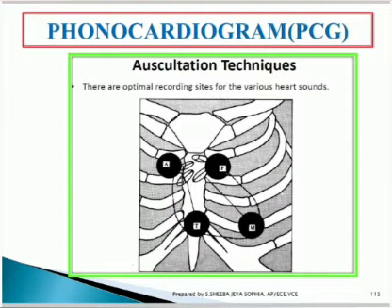Another major measurement is the phonocardiogram. Phono refers to the sound wave, which we also know clearly, and cardio refers to the heart. So the sound of the heart is measured by using the PCG measurements. Here you can see 4 positions are marked to find this heart sound.